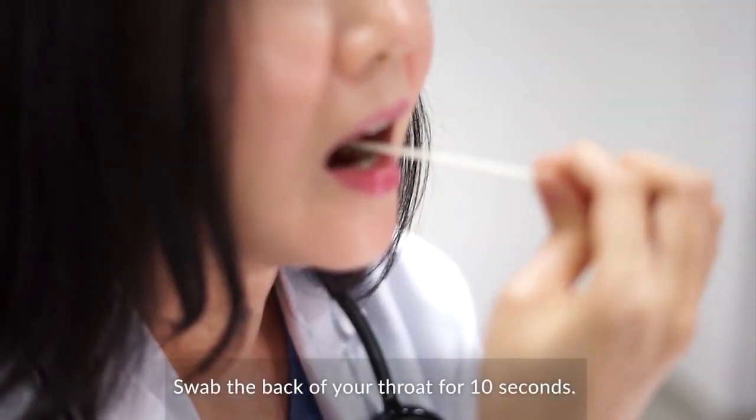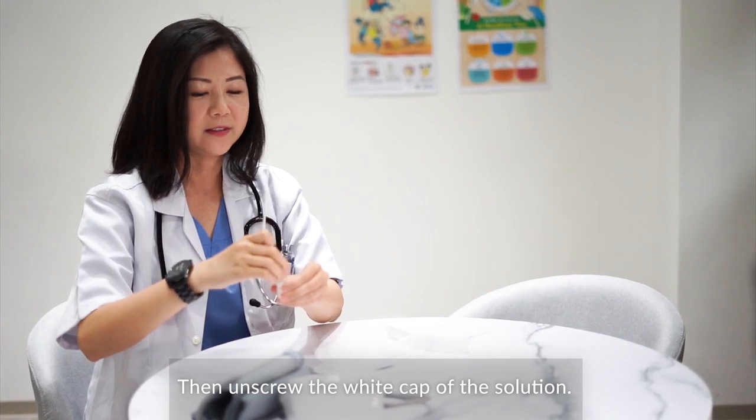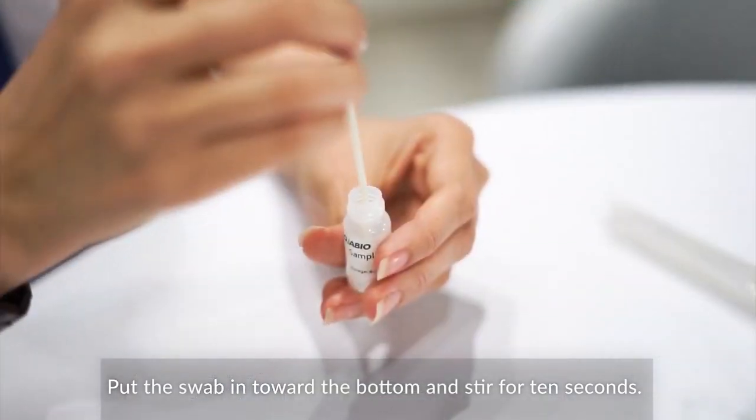Swab the back of the throat for 10 seconds, then unscrew the white cap of the solution. Put the swab in towards the bottom and stir for 10 seconds.